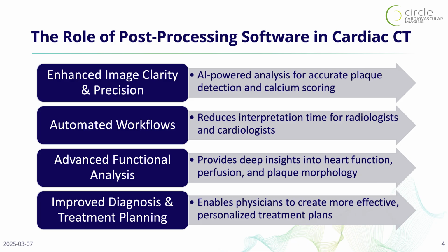It reduces the interpretation time for radiologists, cardiologists, and I would also say lends evaluation into the primary care field. Advanced functional analysis provides deep insights into heart function, perfusion, and plaque morphology, and improves diagnosis and treatment planning. It enables physicians to create more effective and personalized treatment plans.